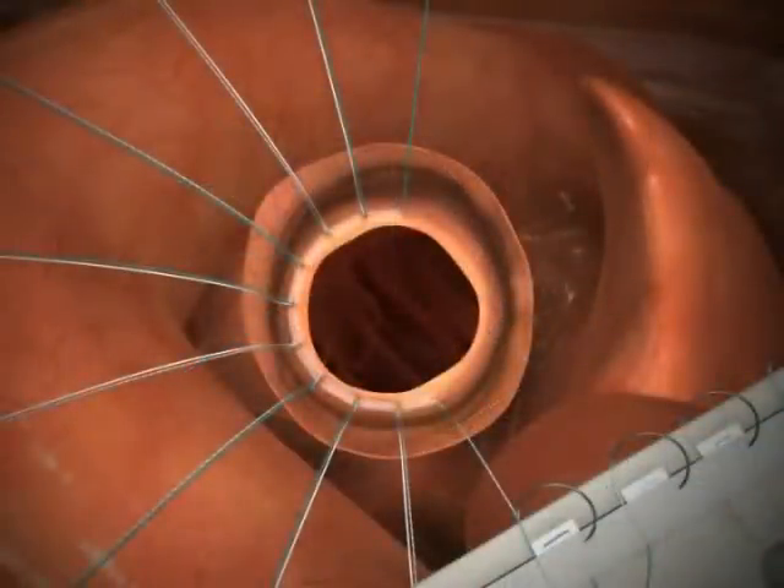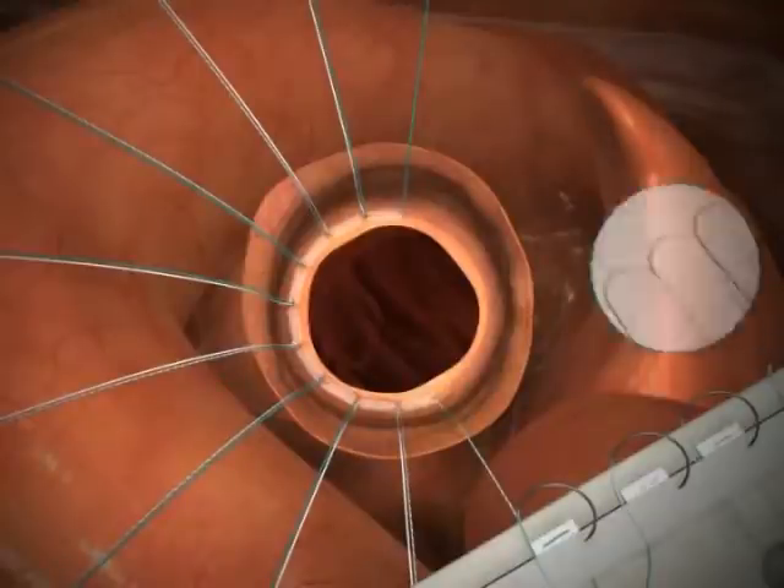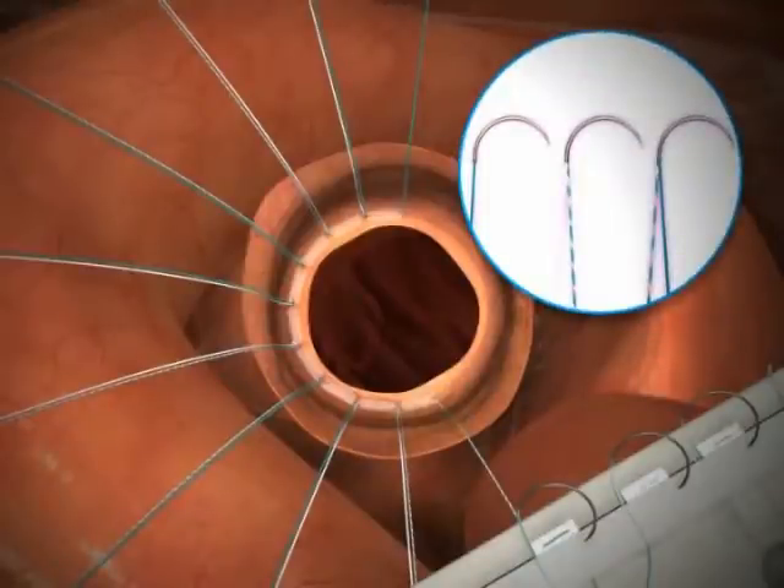Complete suturing around the annulus. Organizing the sutures is routinely done, although you will find it is no longer necessary to separate colors, as two colors now share one needle.